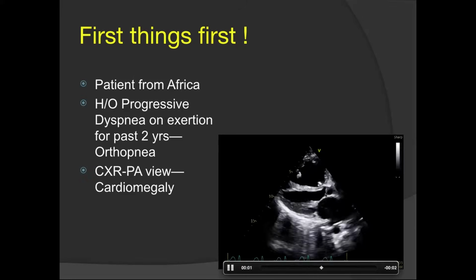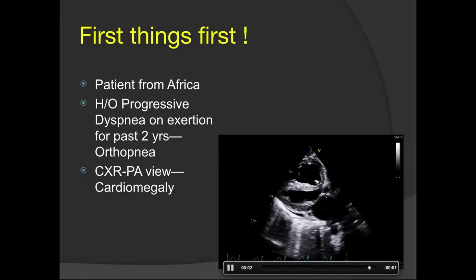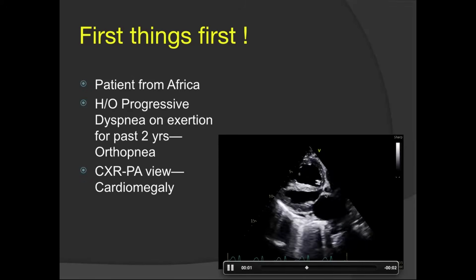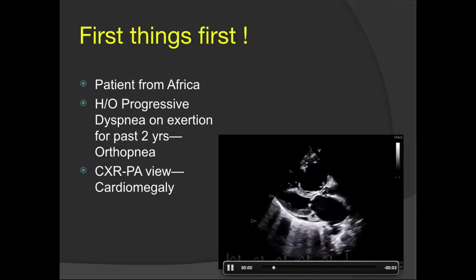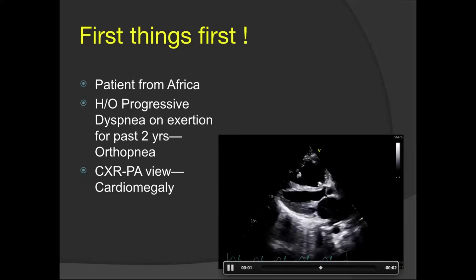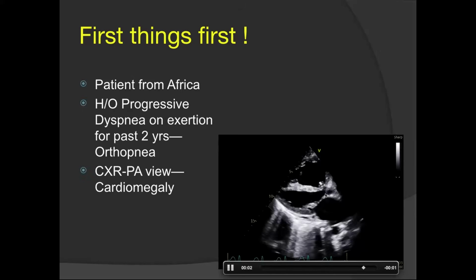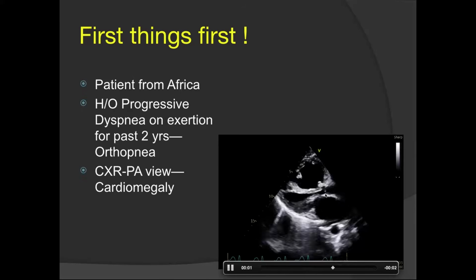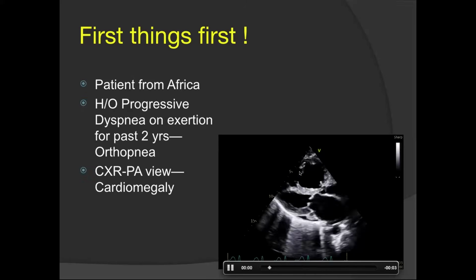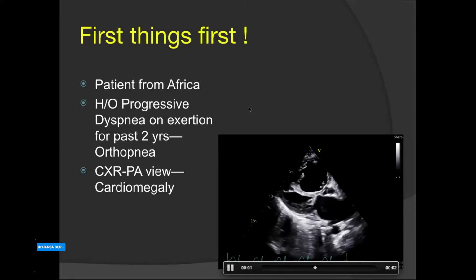You've forgotten to look at the left side, only looking at the right side. There is mitral stenosis. Very good. Mitral stenosis is there, there is LA enlargement, there is some pericardial effusion, but MS is very apparent. So immediately we know probably this MS is the cause of RV dilatation. We will also have RA dilatation. So with the first image, we have already concluded if we have a thinking mind with background knowledge.